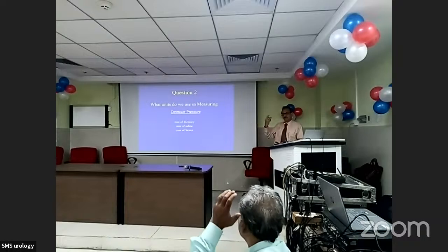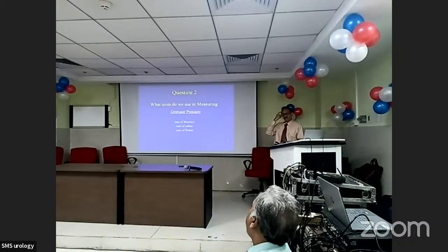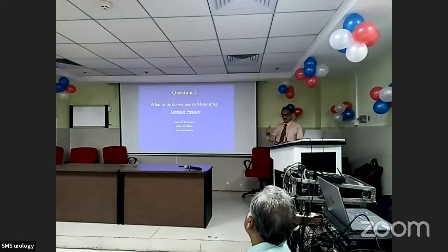Right. So first of all, you will get a history right. You just generate urodynamic questions. One thing that I have to emphasize is that after taking the patient's history, maybe incontinence, maybe obstruction, maybe something else, you have to generate the questions for which you are looking for answers.